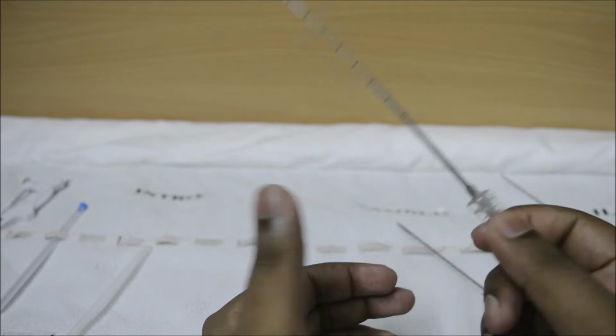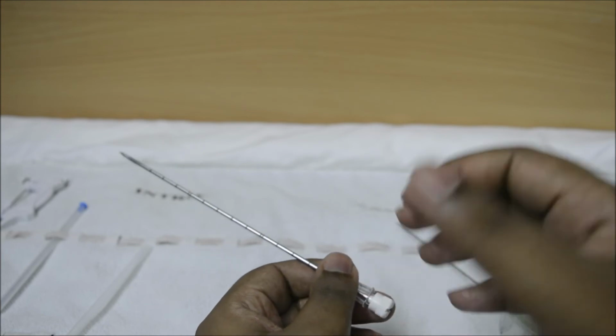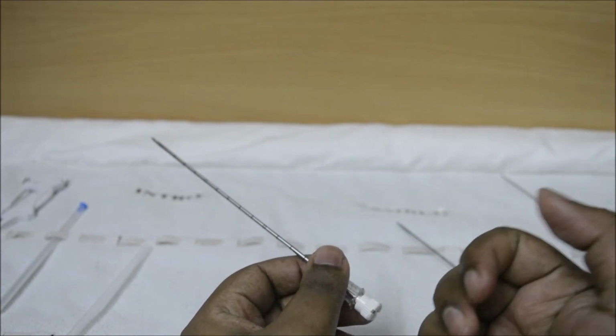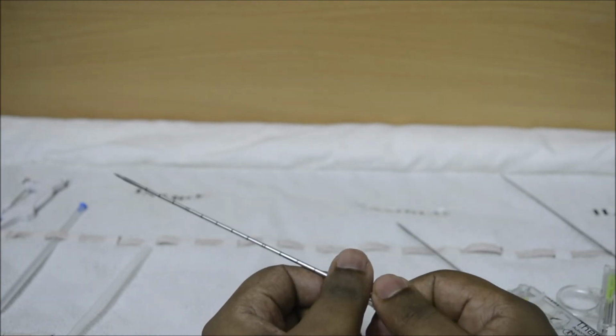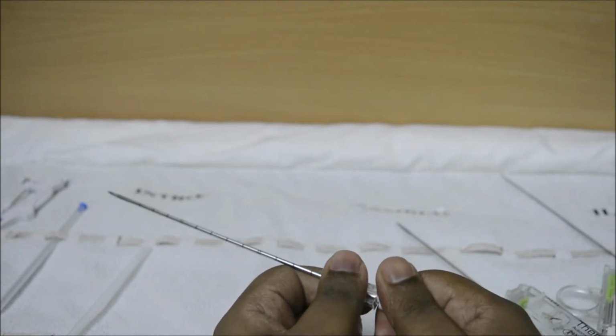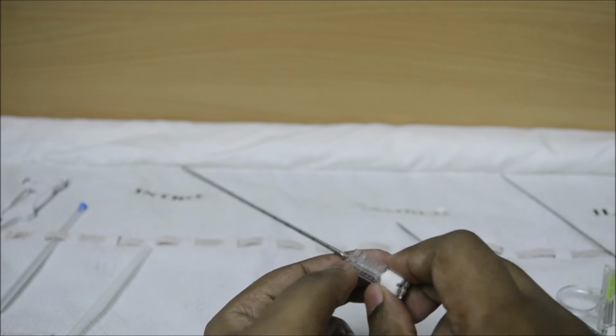For that reason, if we don't use a coaxial needle, we have to perform all the procedures separately at different times, and new insertions to the patient's body have to be done, new prickings, so it is painful as well as a hassle for the patients as well as the doctors. So there comes the function of a coaxial needle, which works in the following way.